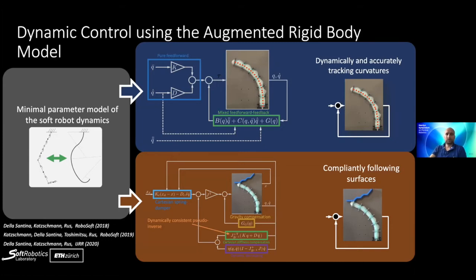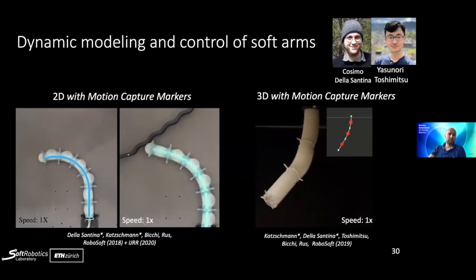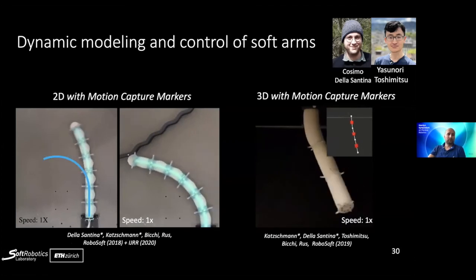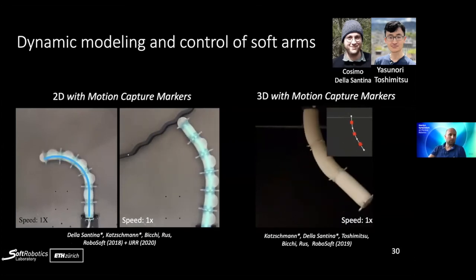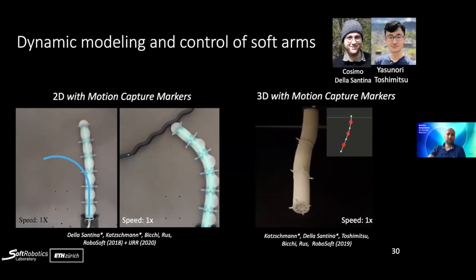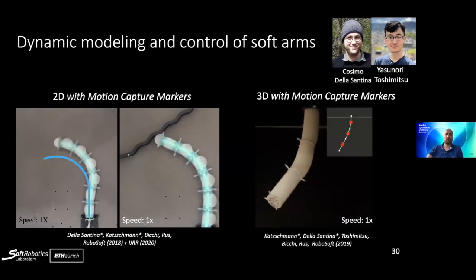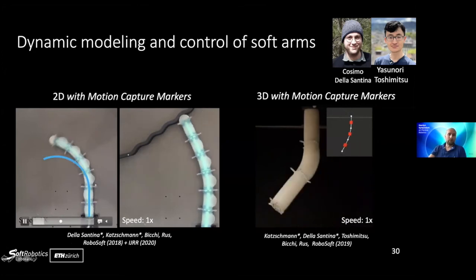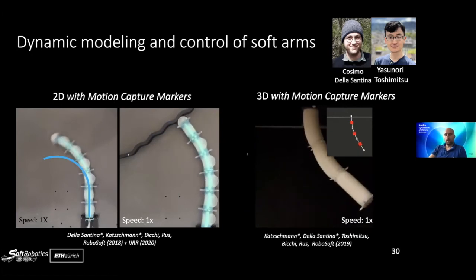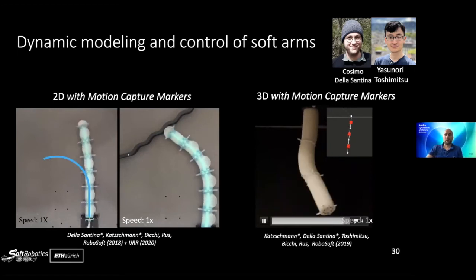I'm not going to show much of the results to this work, but here you can just see it in action on the left. So this is, for example, following an element where we are keeping the bottom 2 segments stiff and the top 4 segments are actuated. Cosimo earlier showed our S-shaped arm. This was another example where we used it as a 4 segment that is being controlled while the rest is being, quote unquote, kept stiff, even though the whole soft arm you see on the left is actually completely soft. And then we also were using it to track the environments and to do compliant tracking, or we were using it to do 3D tracking. But all of this, to be pointed out, was using motion capture markers.